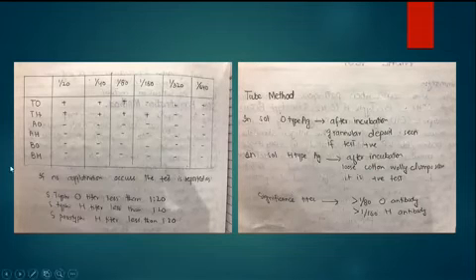So here again you can see the test. This is supposed to be one positive test, in which you can see that the positive signs show agglutination. For the O antigen, all these dilutions have shown some agglutination. So 1:80 is the titer, and compared with the significant titer, which is 1:80, this is going to be positive. And for the H antigen, these are the positive agglutinations, and the titer is this one, 1:160. Comparing it with the significant titer, which should be greater than or equal to 1:160, this is again positive. So this report is positive for typhoid fever.